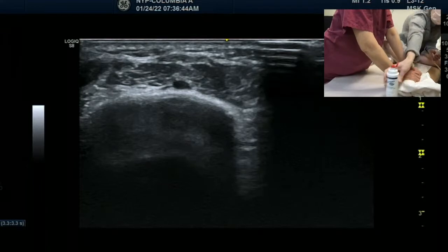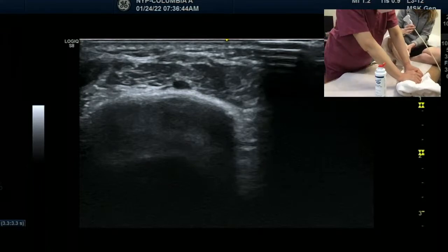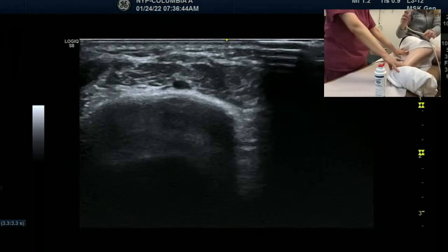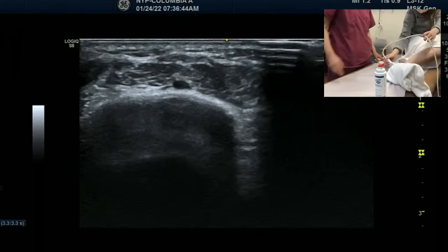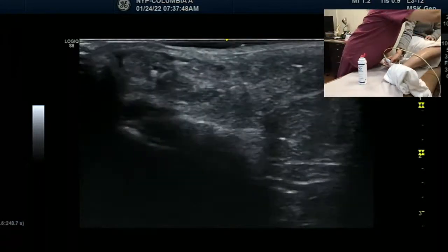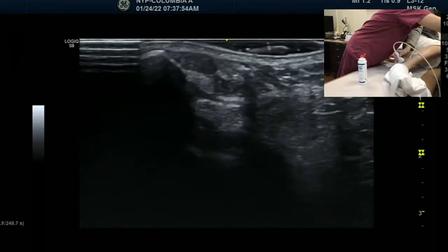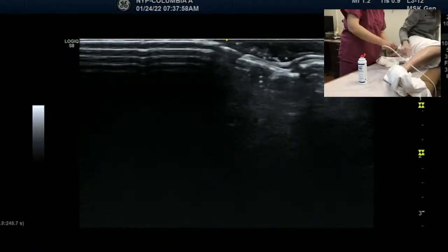It's easier for me to find on myself. Oh, the sural nerve is hard. That's why you have to practice this one. Don't go with the easy one. She wants to do the easy one today. It's just hard. I was practicing with a butterfly, and it's hard to find the sural nerve, because if you don't track it down, it's hard. You have to start from the beginning. I'll do it, it's easier. I'll be your assistant.